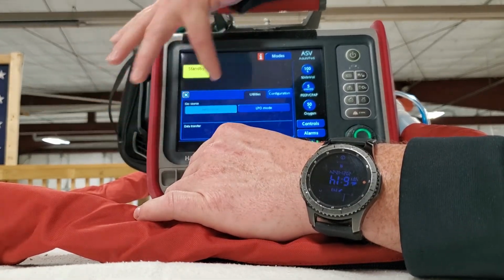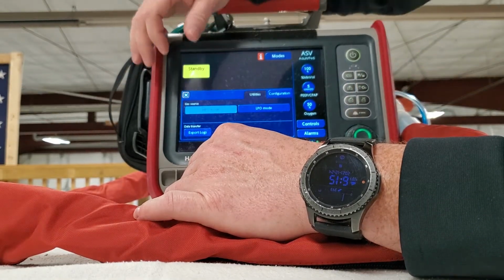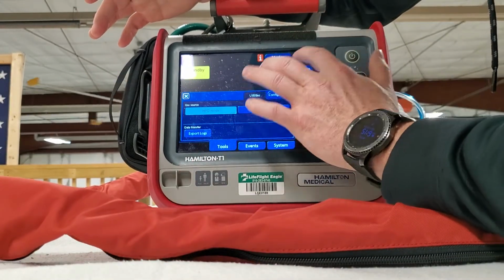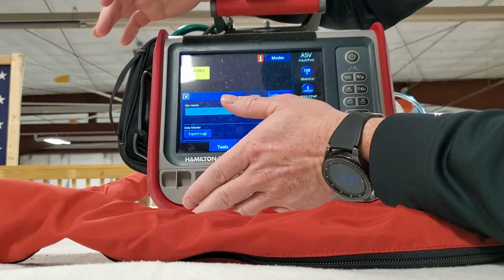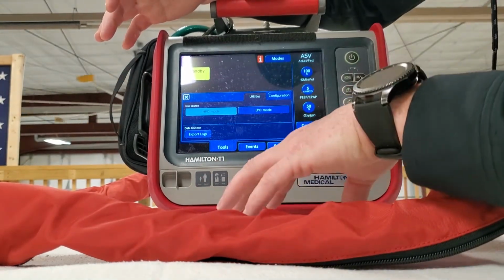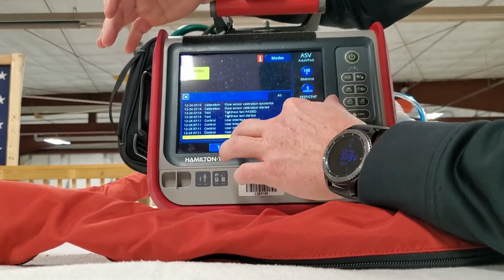But once you turn the ventilator off, and then you decide you want to get that stuff, if you went in and had already entered some new settings and confirmed another ventilation, you can't get into it. So you can either get your events right afterwards before you turn it off, or you can turn it back on and go to last patient. But if you enter anything and restart it, you can no longer get it.